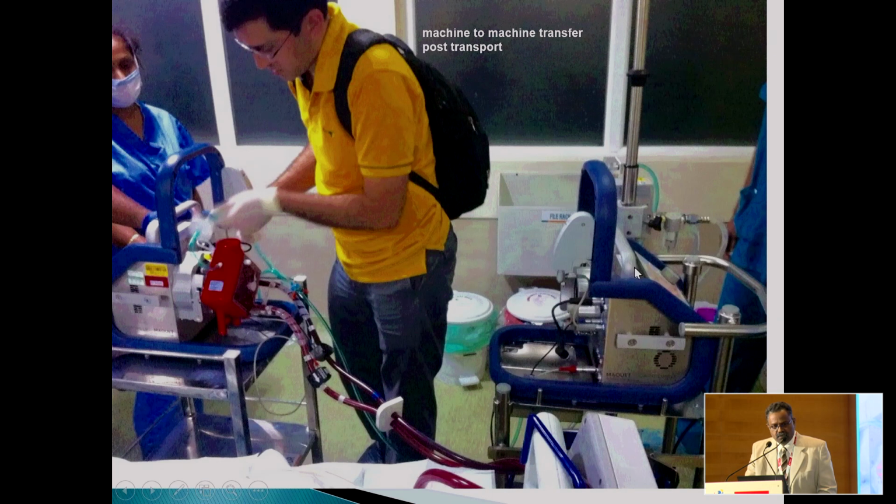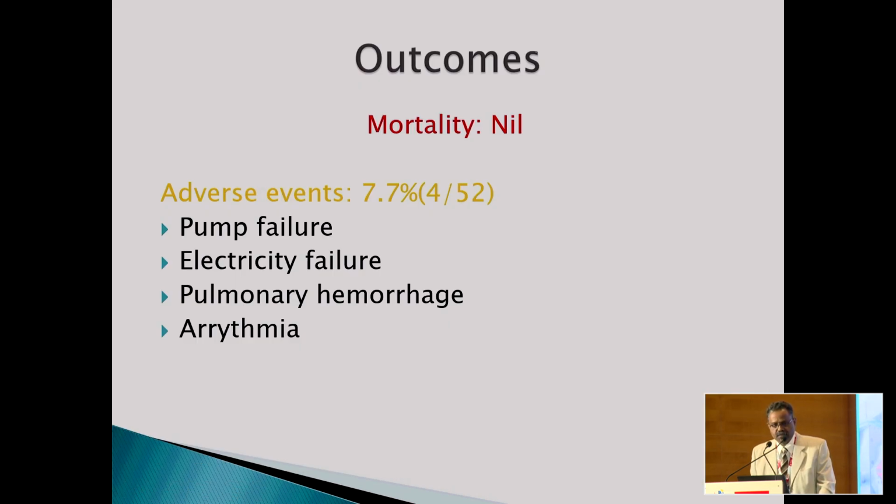When both machines are the same machine, only the pump head or the oxygenator alone can be changed. This should be done quickly. This is a ready machine to receive, and this is to be deployed. The oxygenator will be transferred here, and then this machine will be taken over by the team which sent the patient. Outcomes: our mortality during transfer is nil.